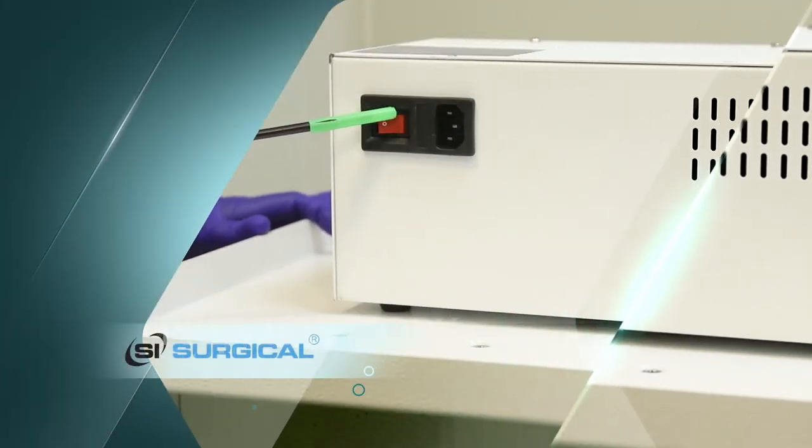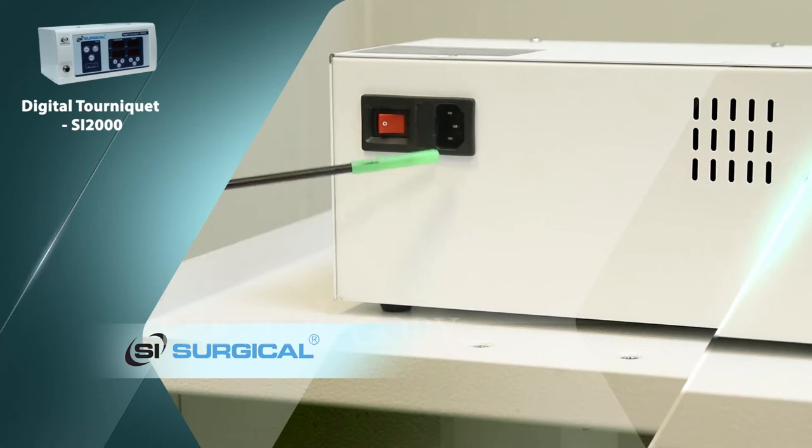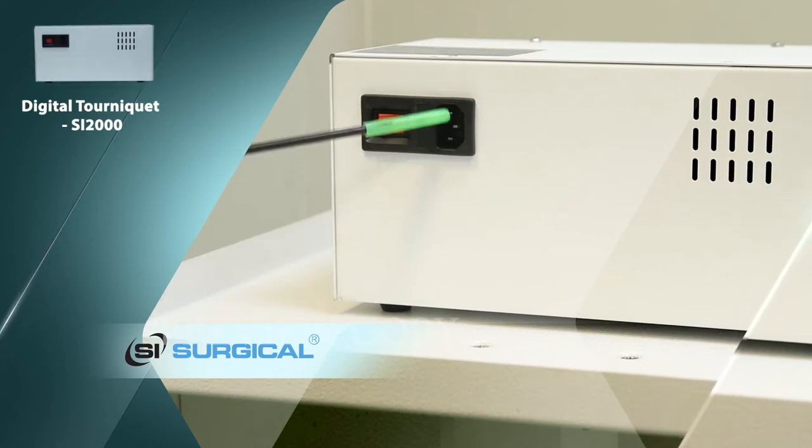This is the main switch and the fuse. This is the power cord connector. This uses AC power.